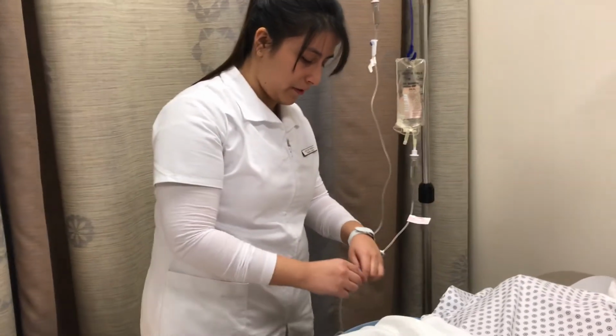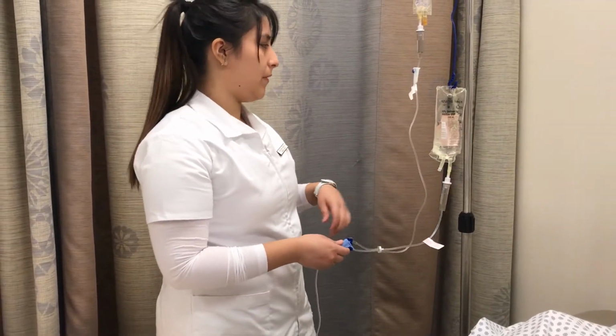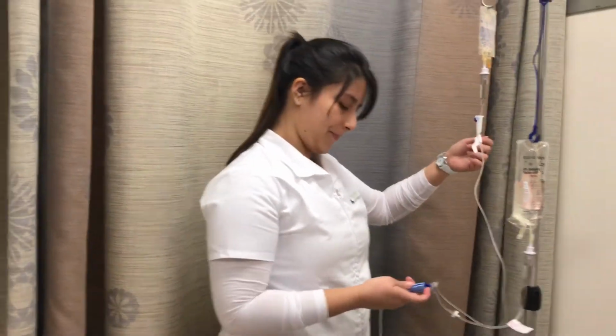Because I will adjust the rate of flow to 16 drops per minute, so that would be 4 drops per 15 seconds.